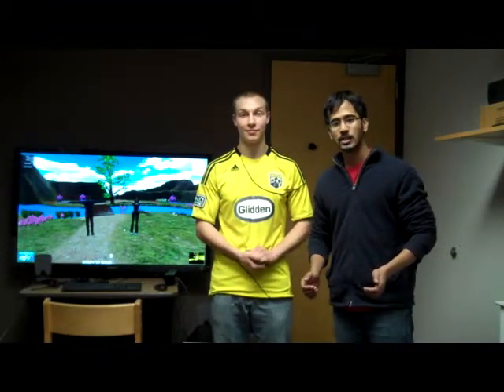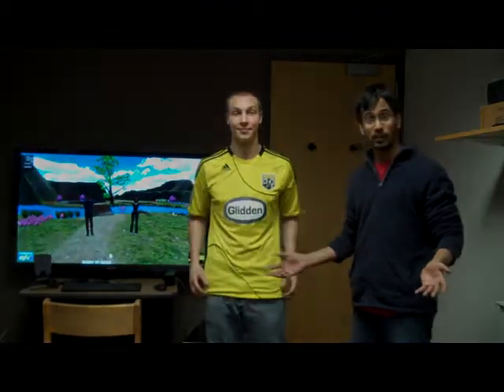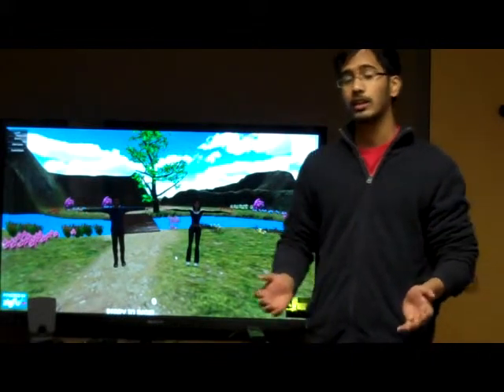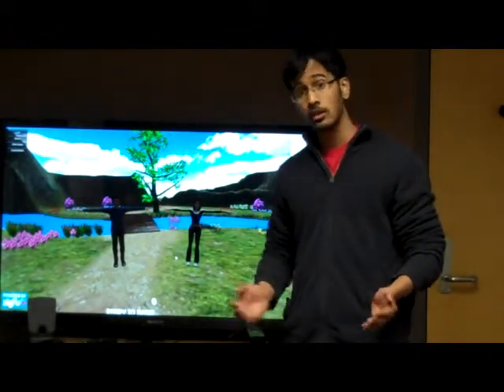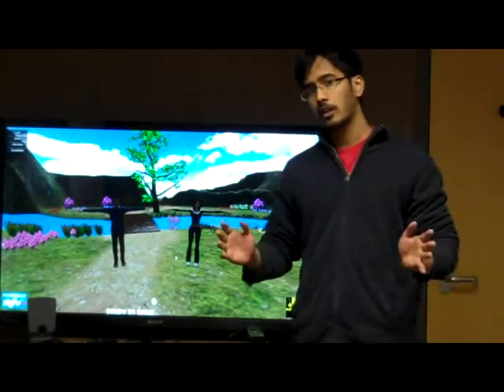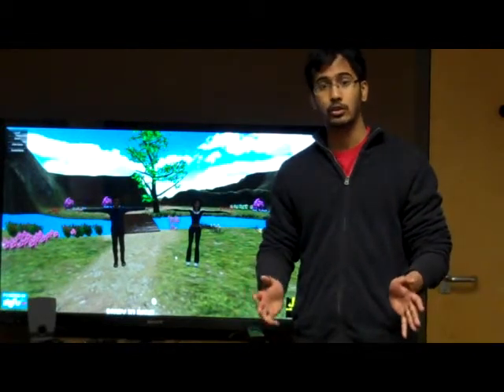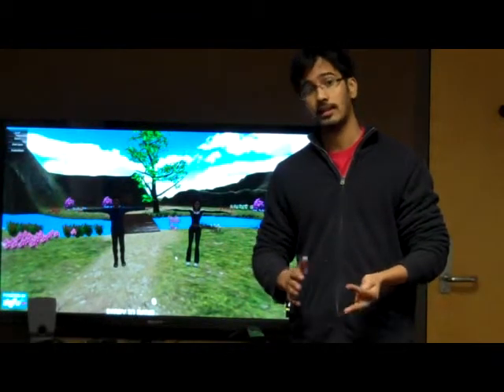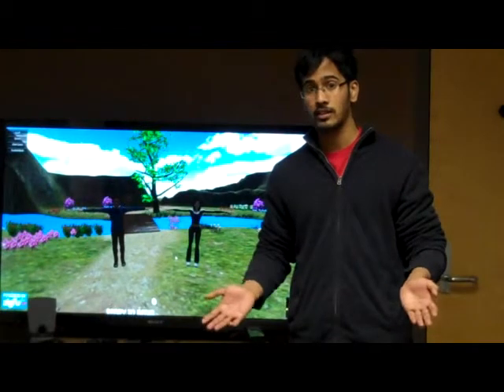And I'm Mansur. And today we are going to show you a system that we've developed here at Ithaca College. The system is intended for patients with motor difficulties to improve their motor skills through video games using the Microsoft Kinect. Now, our implementation is divided into two parts. The first is a game and the other is a therapist's interface.